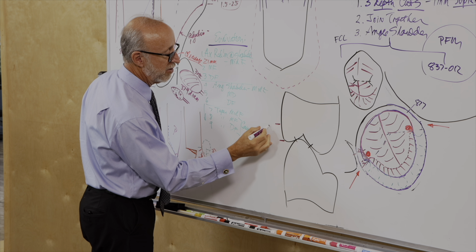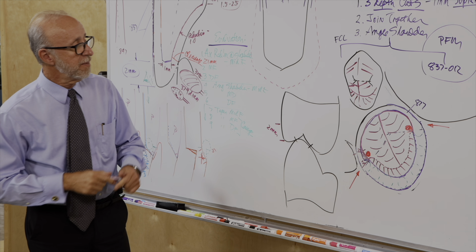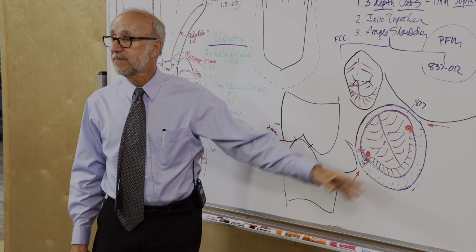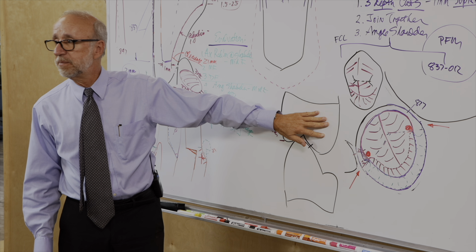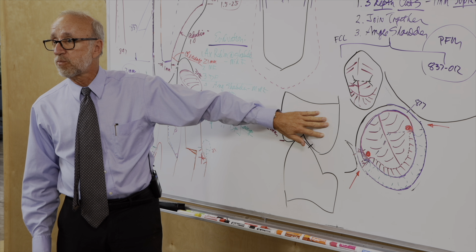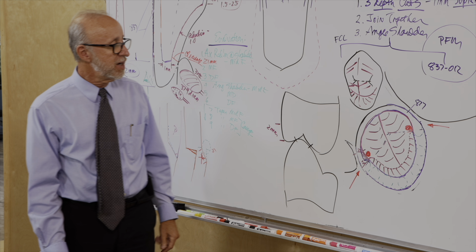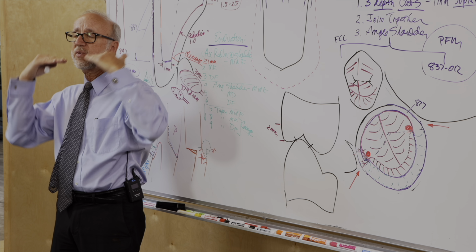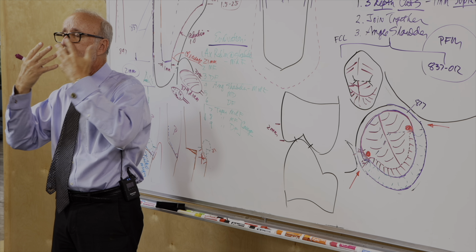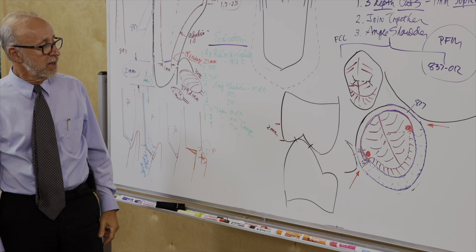For the premolar, we want 2 millimeters reduction on the facial cusp because the facial cusp of a premolar is basically a canine. I mean, the premolar is just a canine with a really big cingulum. Okay? The lobe structure is the same, so it should be pretty familiar. But the aesthetics on the upper arch, we want to make sure we get a full 2 millimeters reduction on all these facial cusps so that the lab can make lots of porcelain over there and have it look ideal.